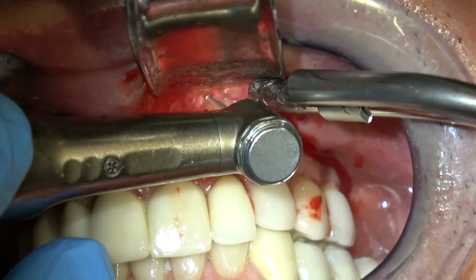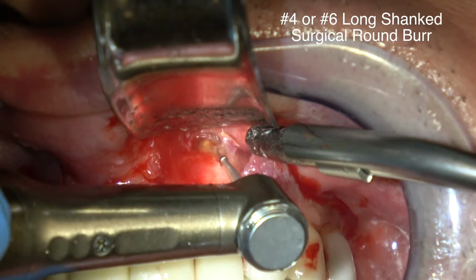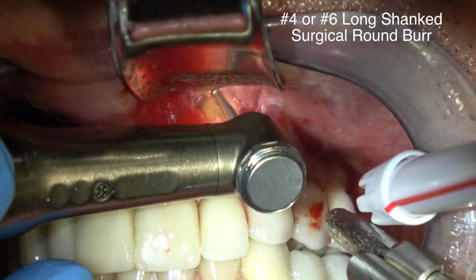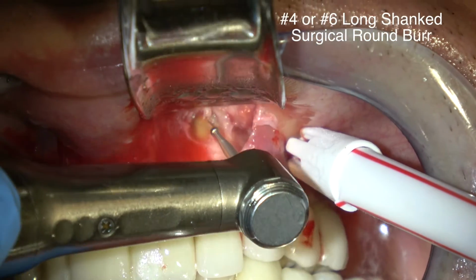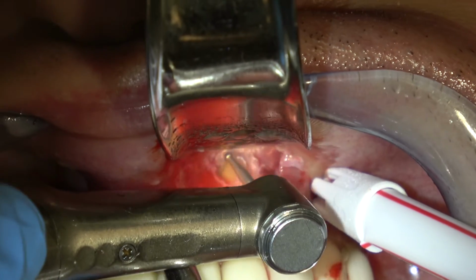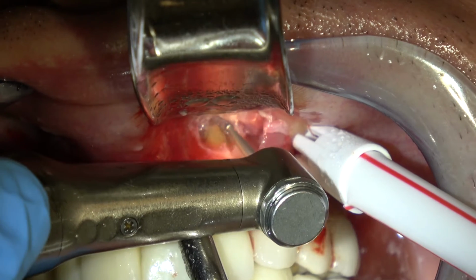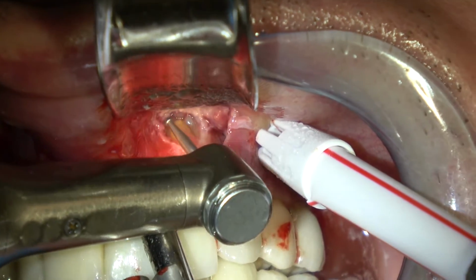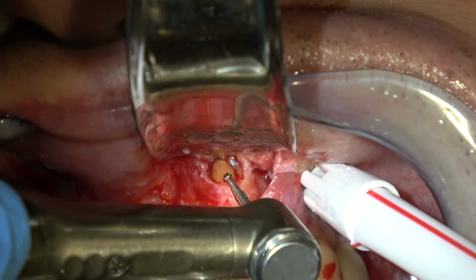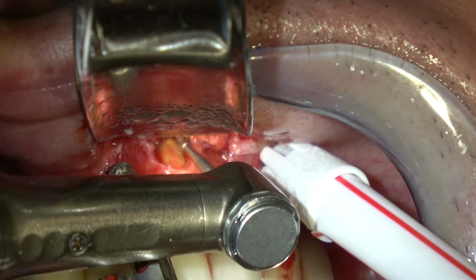Now this is a number 4 or 6 long-shanked surgical round burr. High speed, lots of water, very light touch. And what I'm doing is just removing the bone around the apical part of the root. And I'm beginning at the hole in the bone. And I'm just uncovering the root of the tooth very lightly.